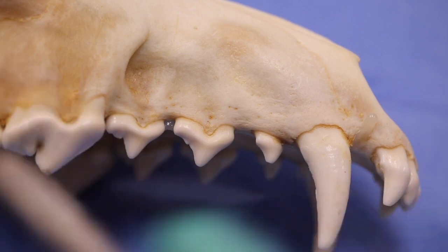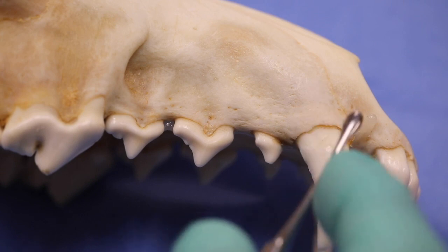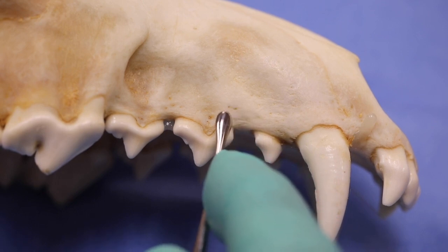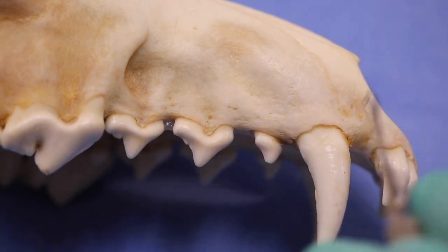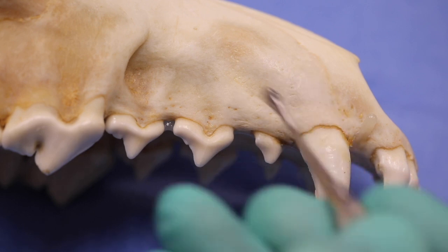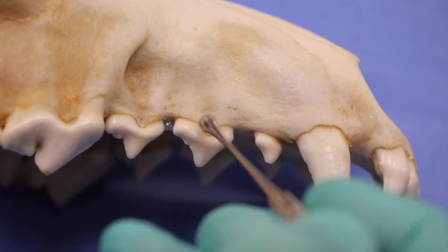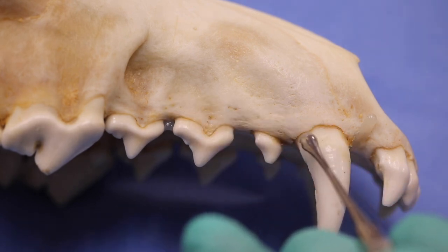So all those concepts are the same when we turn that over after we've got that margin started. We use a large end, and we can get much more aggressive with that. Again, using the same concept here where we're turning that attached gingiva off of the bone, and then once the attached gingiva has been lifted, then we can get more aggressive and we can start to move apical, again pressing down on the bone and then moving apical once we're into that unattached gingiva, which releases quite nicely, much easier than it would if it were just the attached gingiva.